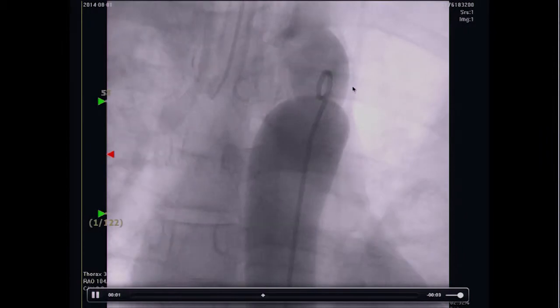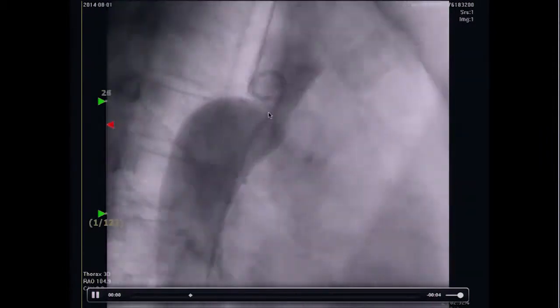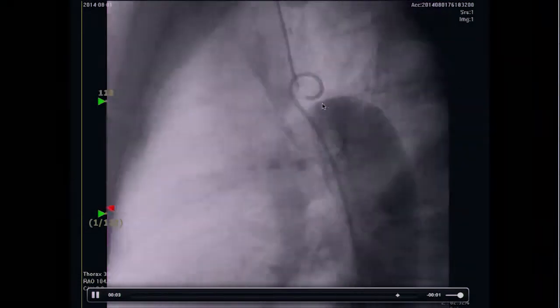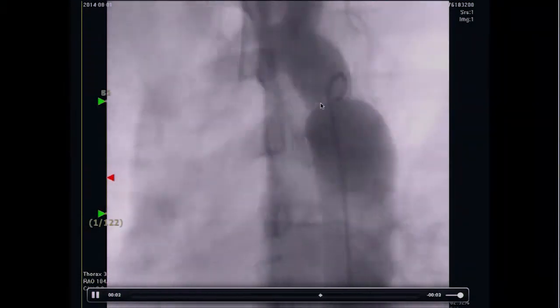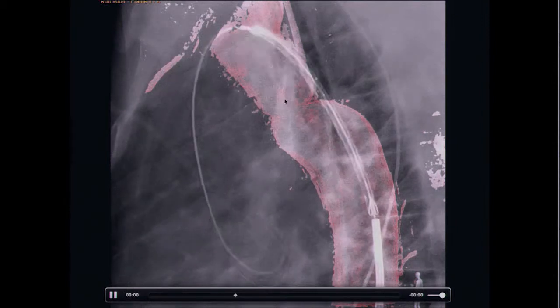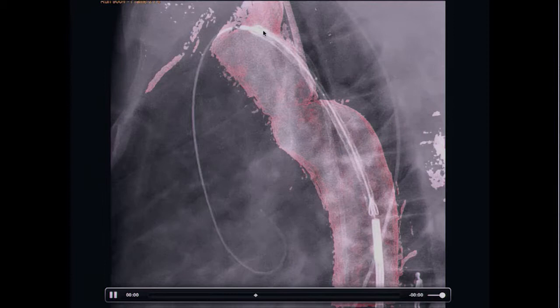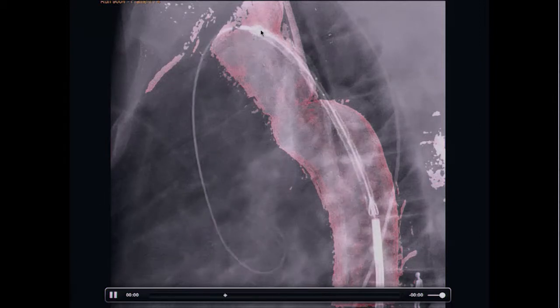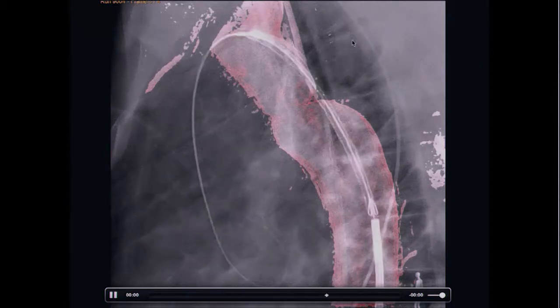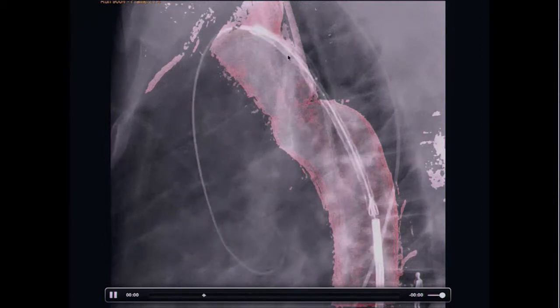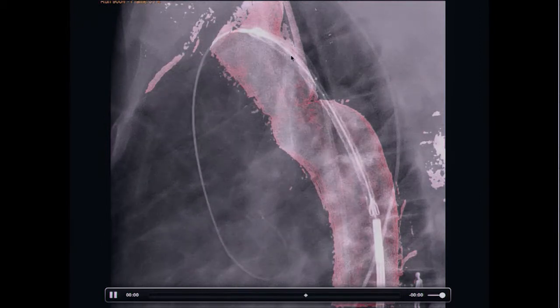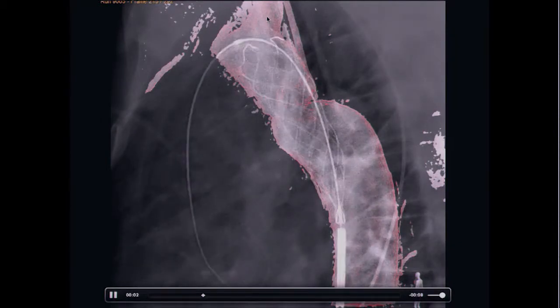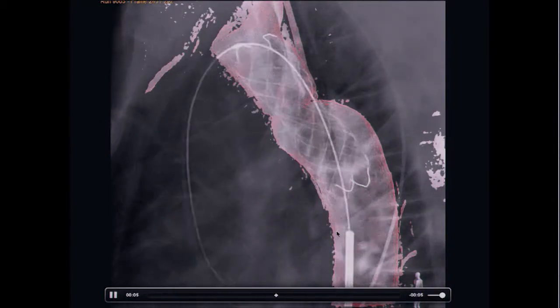This is another case: coarctation of aorta. There is a pressure gradient of about 15 mmHg, and using the rotational angiogram we could see the stenotic area on the descending aorta. I applied the roadmap here, but as you can see, the stent position was a little bit deep — it may disturb flow to the subclavian artery — so I pulled it back a little and opened it. I used a self-expandable stent on this patient, opening it so as not to disturb subclavian artery flow.